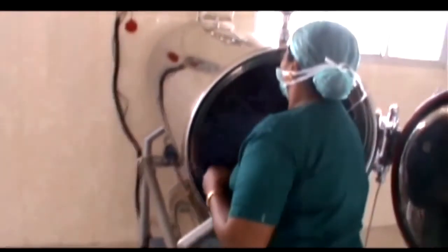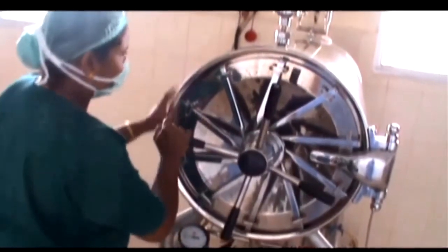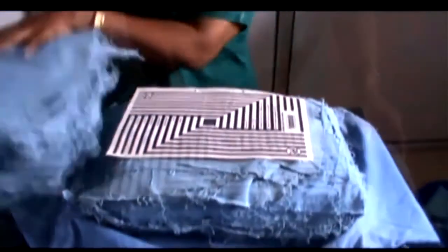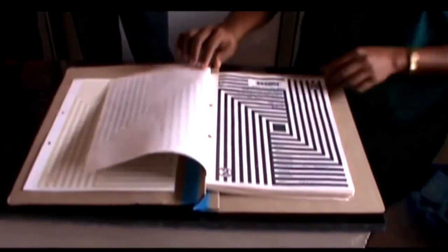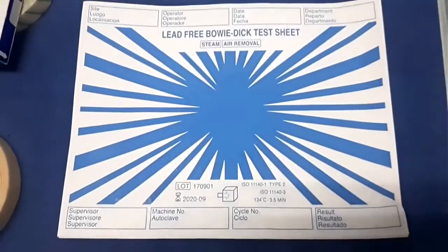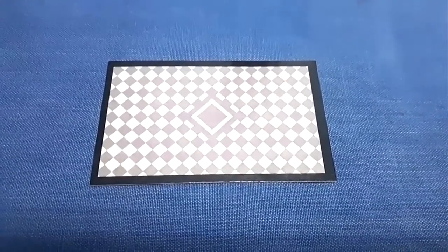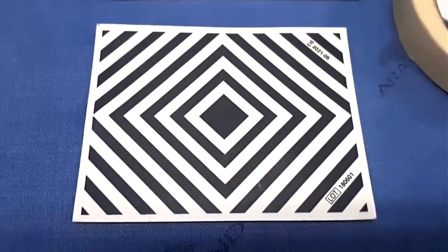What is being demonstrated here is the Bowie-Dick test. You put a sheet in between the sheets, and this has to be periodically done to check whether your autoclave is working properly, whether the vacuum cycle is working properly, and please retain those sheets in a file to prove that your autoclave was working and there's nothing wrong in your sterilization if something goes wrong. These are the lead-free Bowie-Dick test sheets which are available now, which can be used. These are the different models available in the market.